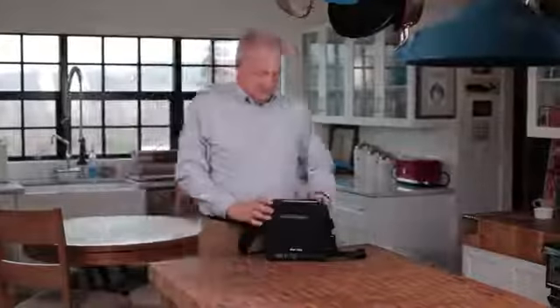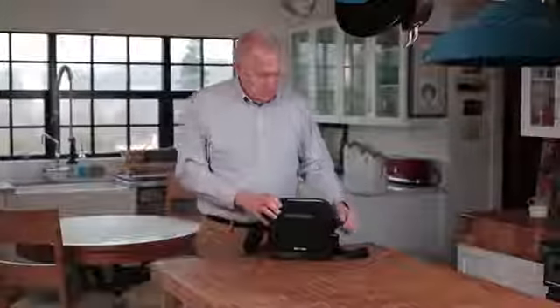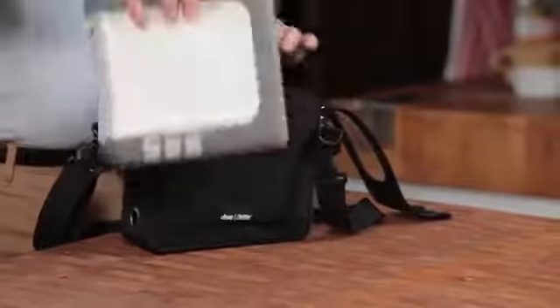The iGoTo ships in the carrying case. Carefully unzip the carrying case, remove your iGoTo, and review the contents to ensure that you have received all of the necessary parts.